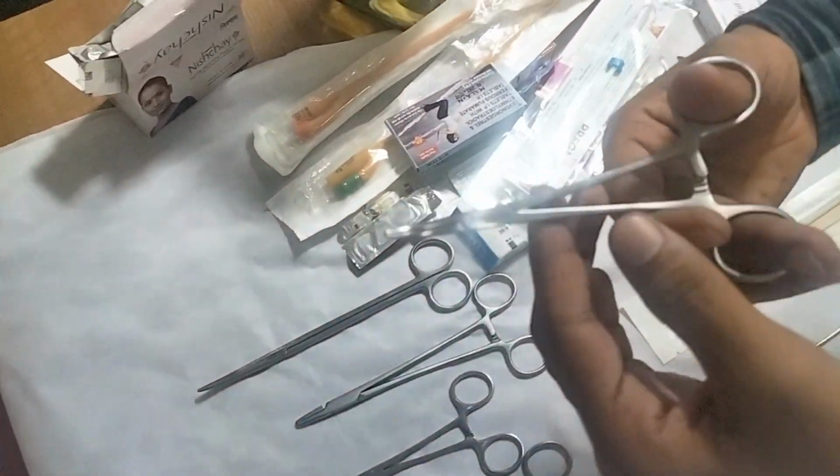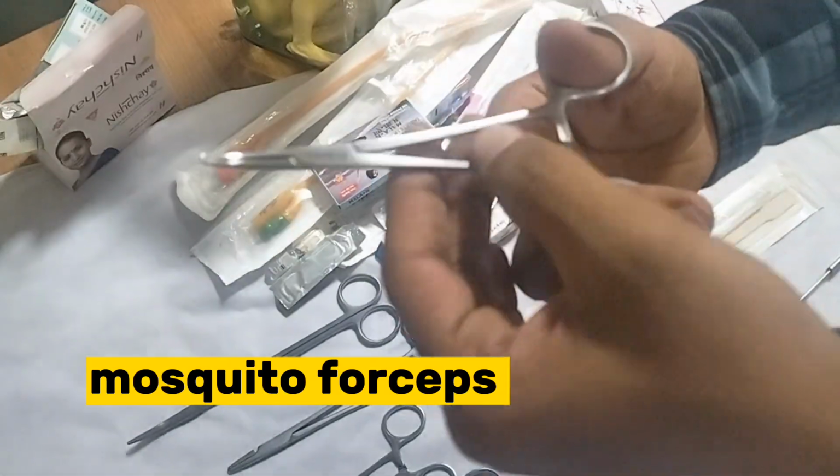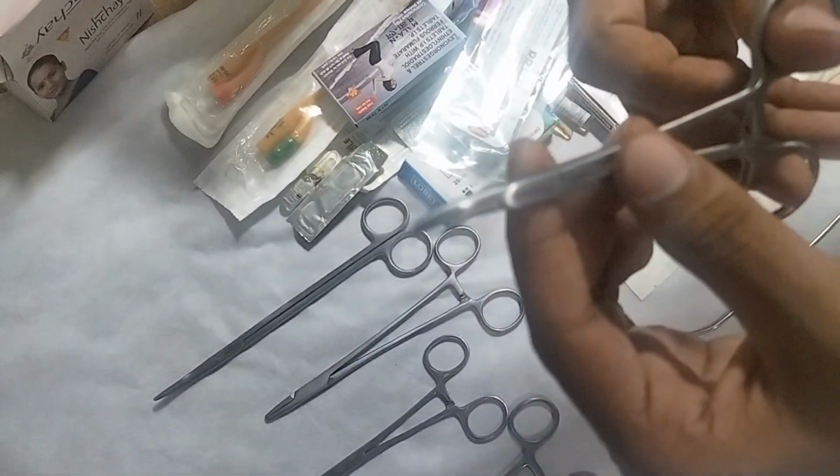This is mosquito forceps. In the proximal part you can see a ratchet lock mechanism, small shaft and curved with serrations in the distal ends. Okay, this is the mosquito forceps used to hold the small arteries which are bleeding during surgery. So one more thing which was remaining was the towel clip. Okay, the towel clip holds the draping materials, fiber optic tubes, cloths and gauze pieces for draping purposes.